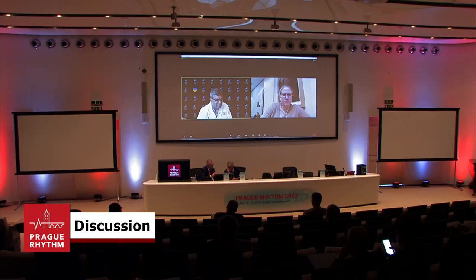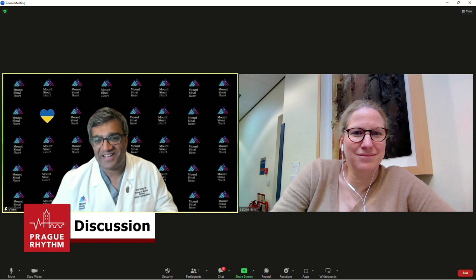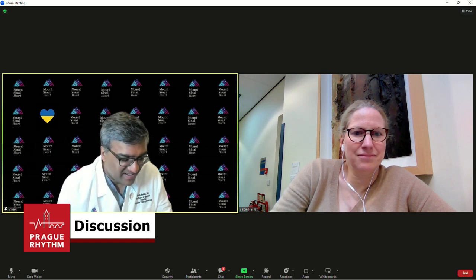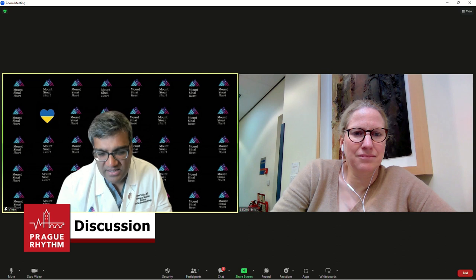No, I guess what I'm saying is, this is not an indictment of pulsed field. I hope that's very clear. You keep talking about 1,200 cases. Those are 1,200 cases with PFA, with PVI and posterior wall. It's a subset that had mitral or CTI. What I'm saying is we should probably consider giving nitro prophylactically more often than we do. That's all I'm saying.